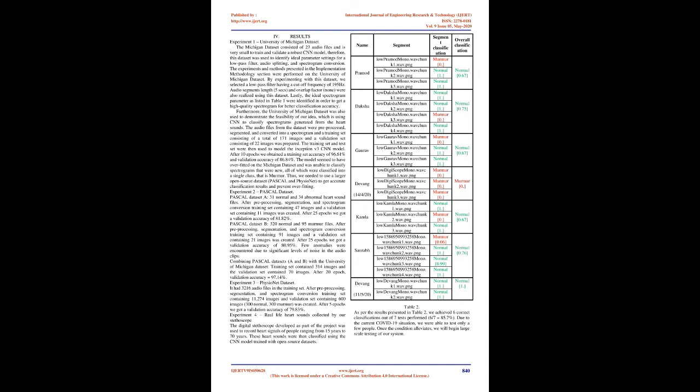On uploading the audio to the AWS S3 bucket, a trigger is executed which runs an AWS Lambda function, which makes a REST API call to our Flask API server. The API takes the audio signal from the S3 bucket using Python's Boto3 library, performs all the pre-processing steps discussed above, and then classifies it using our trained CNN classifier.